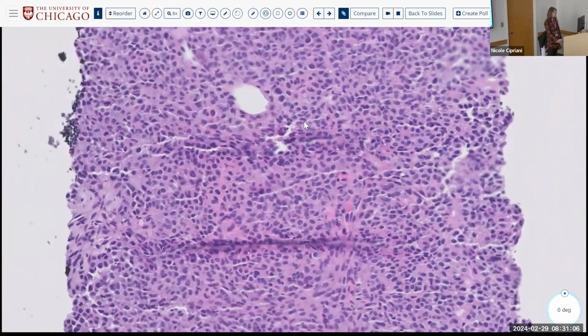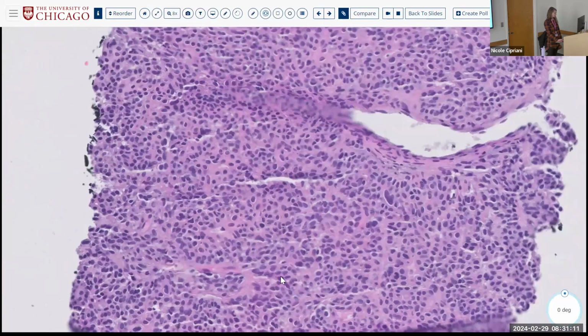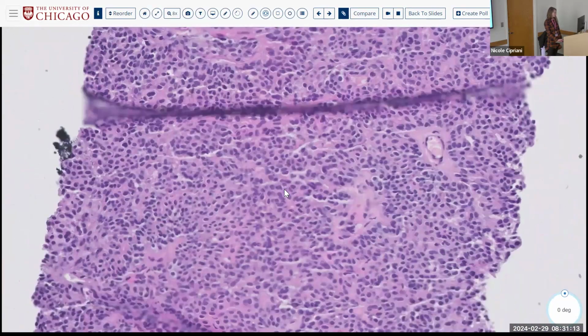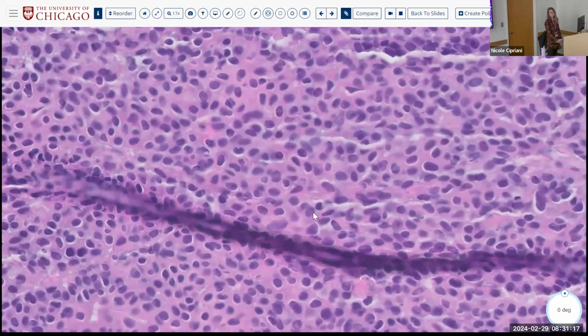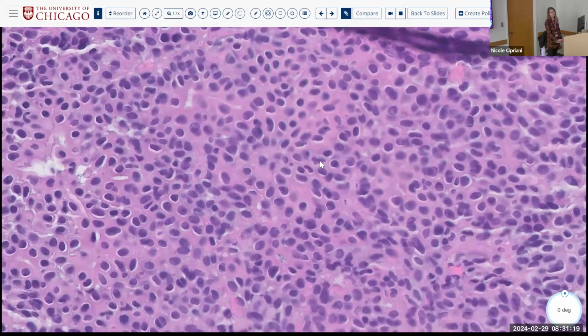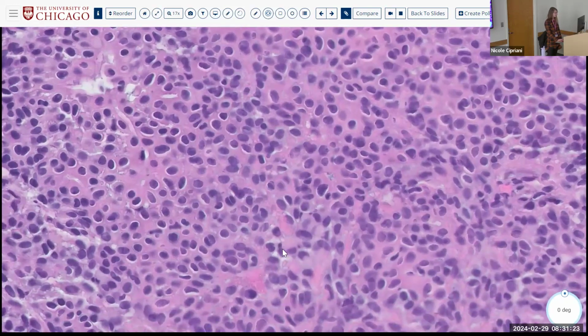Yep, so if you wanna prove that it's biphasic, maybe we can throw some stains on there. But what biphasic tumor does it really not look like? What's the most important biphasic tumor to exclude? Adenoid cystic, right? Because if we think it's adenoid cystic, they may treat it differently, more aggressively, okay?